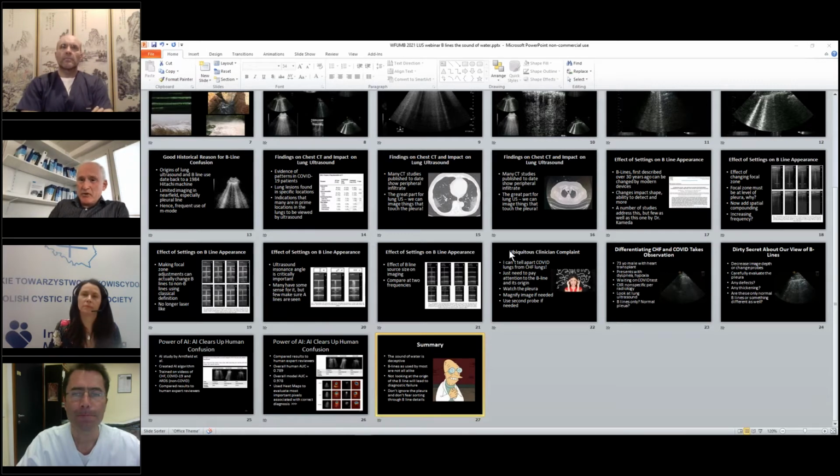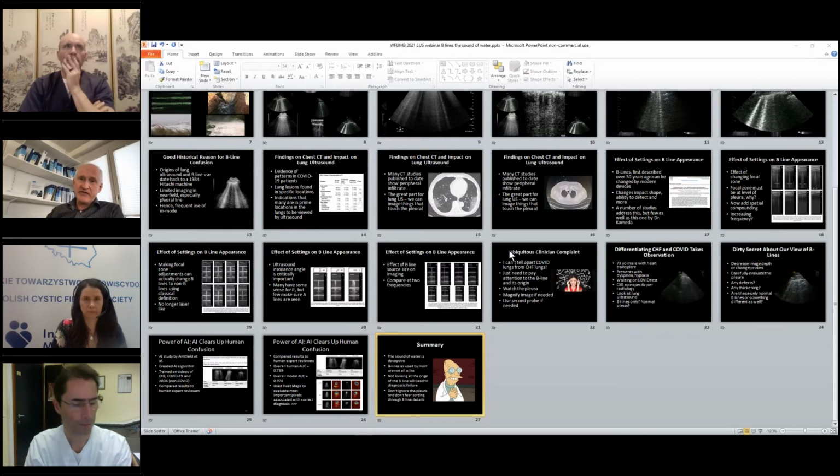Yeah, whenever it supports your hypothesis. If you have any doubts and if you have a pretest probability that the finding after the contrast enhanced ultrasound will give you additional information. So if we have the question of pathophysiological processes of the consolidations, I showed you very nicely that there are thrombotic areas, and you can nicely depict them within the entire subpleural consolidation. So if you are not sure, use it.